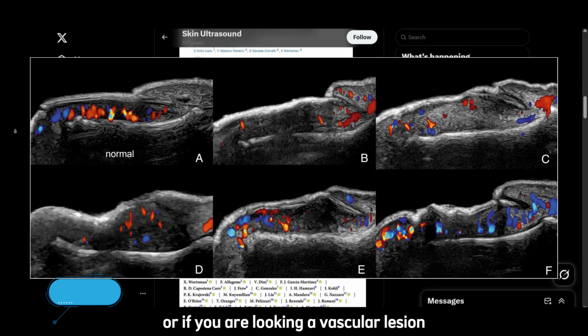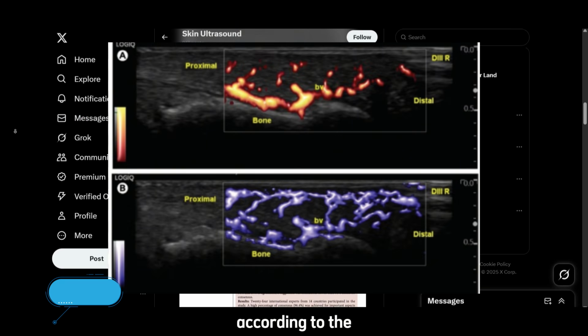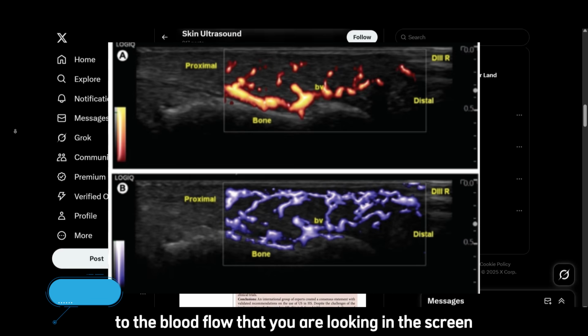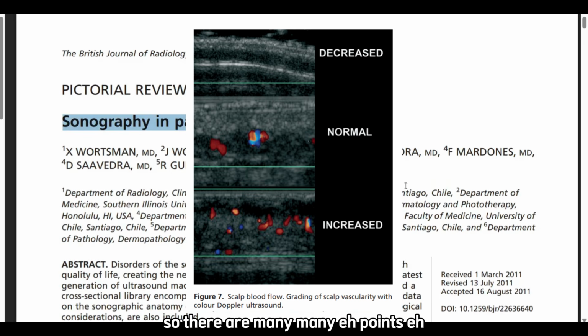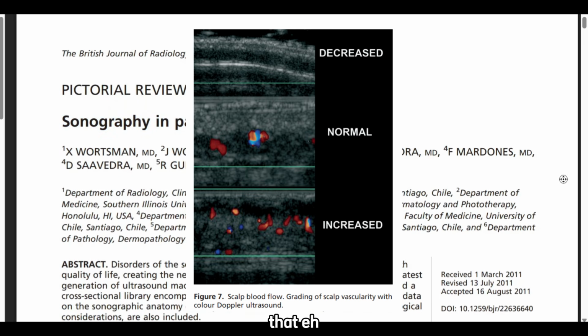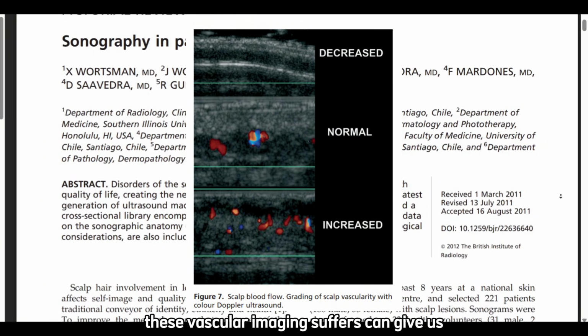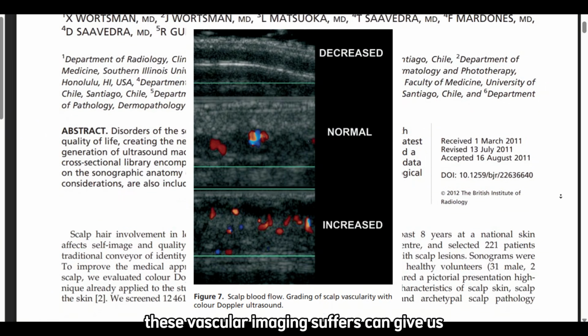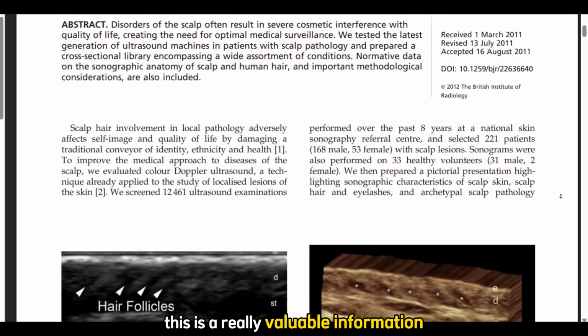Or if you are looking at a vascular lesion, you can discriminate different types of vascular lesion according to the blood flow that you are looking at on the screen. So there are many points that the color Doppler and all these microvascular imaging softwares can give us, and I think this is really valuable information.